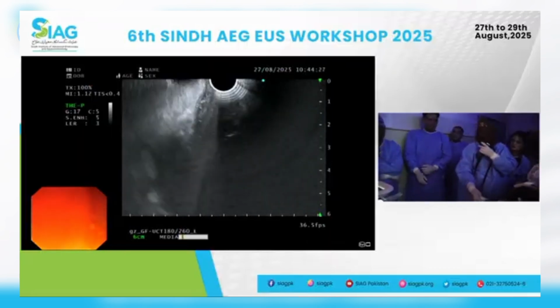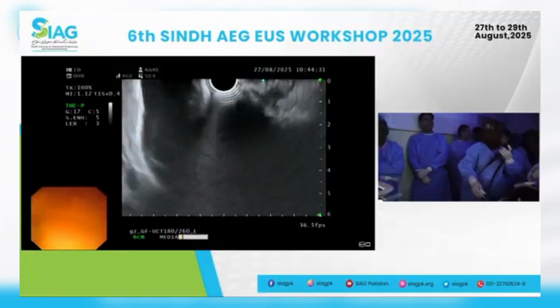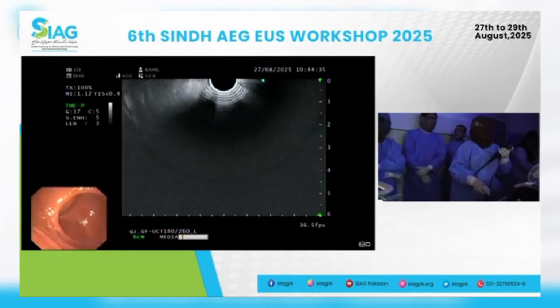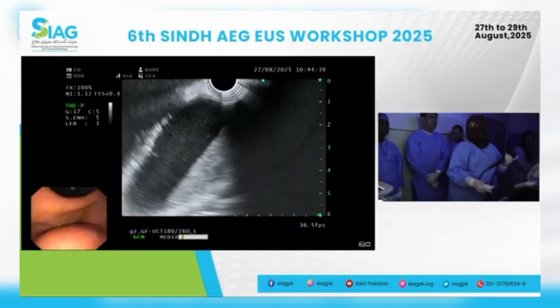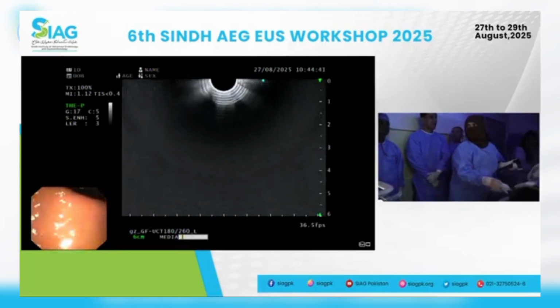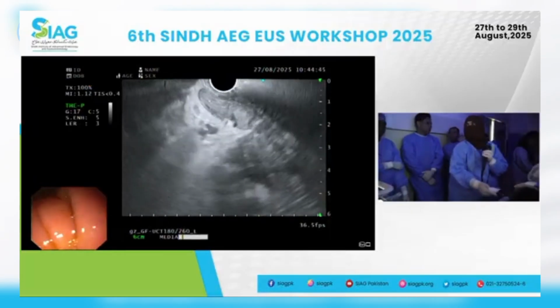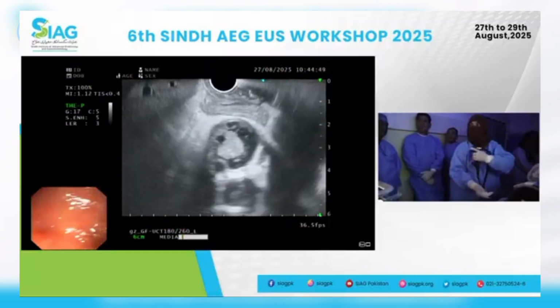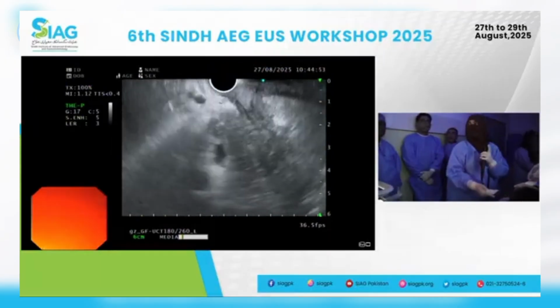So it's fine. That's okay. I mean, it happens, especially if you're not using the balloon. I don't tend to use the balloon. If you're using it without balloon, and when you're shortening the scope from D2, there's always a risk of scope falling back. So it should not be of a major concern. Very nice.